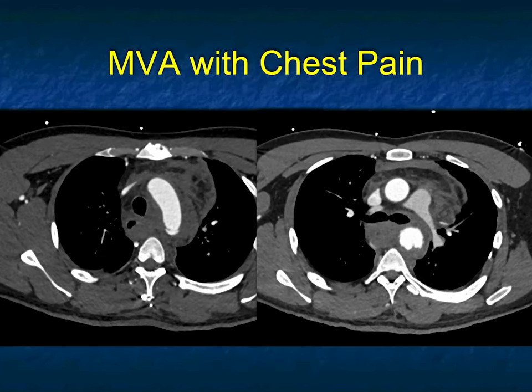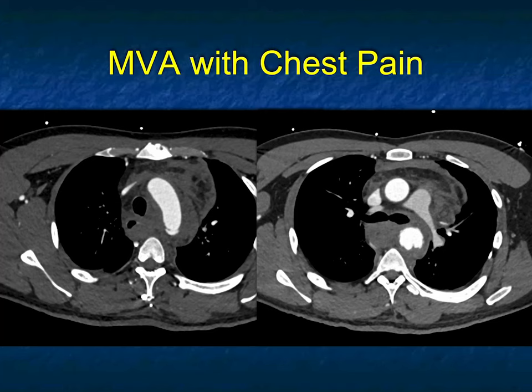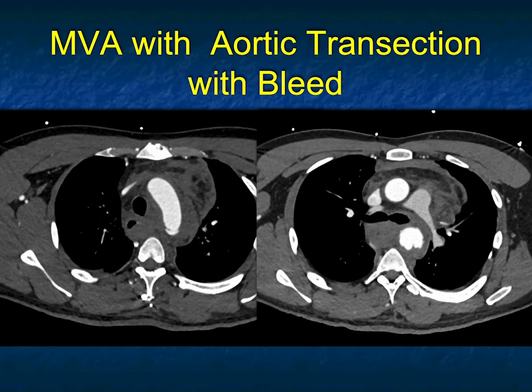Patient involved in an MVA with chest pain. On the images you see blood in the mediastinum, indicating significant injury. There's no obvious sternal or spine fracture visible but that doesn't exclude injury. Looking at the blood around the arch and the proximal descending thoracic aorta, its outline is irregular with a linear line — meaning the patient has transected the aorta. You would look for secondary signs like sternal fractures, rib fractures, spine fractures, and loss of continuity of the aorta.